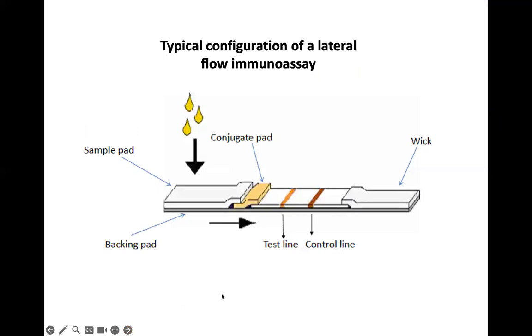I'm not sure how deep your basic knowledge in lateral flow is, but for those who have advanced knowledge on this, please bear with me. I have to cover everybody. So this is the basic structure of the lateral flow, known as the test strip.